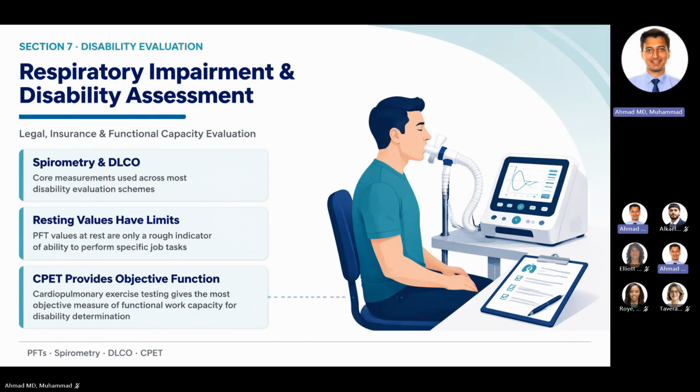It's also great in disability evaluation. Resting values have limited value. Sometimes cardiopulmonary exercise testing is needed, especially for disability evaluation.